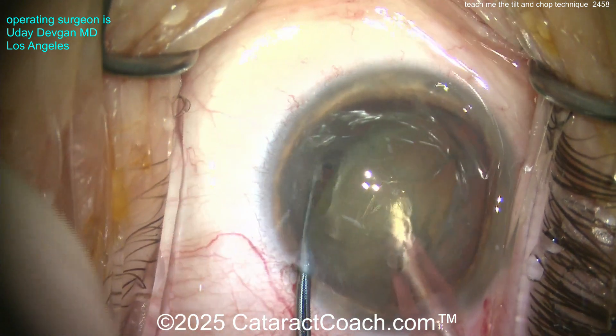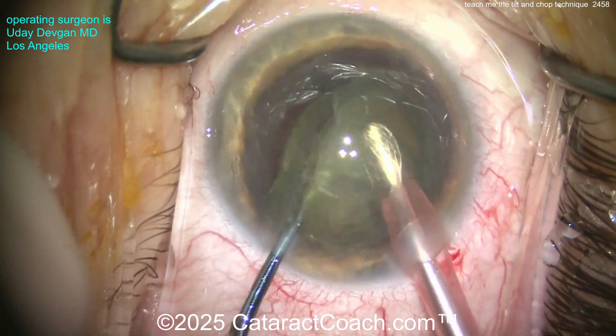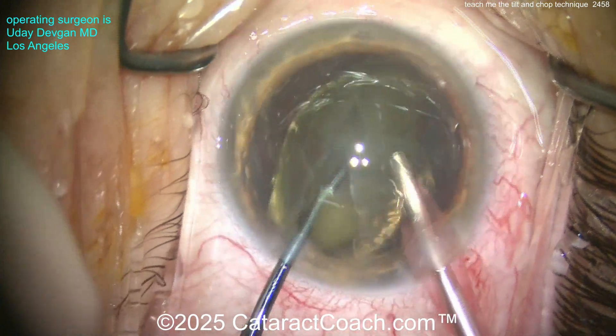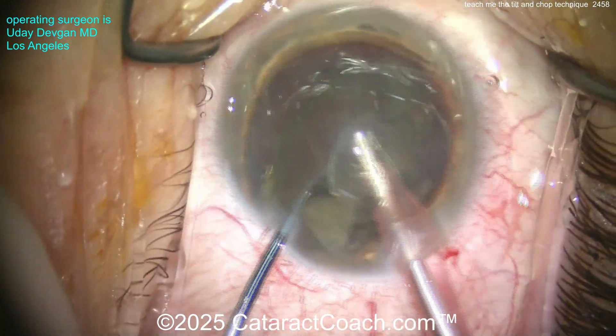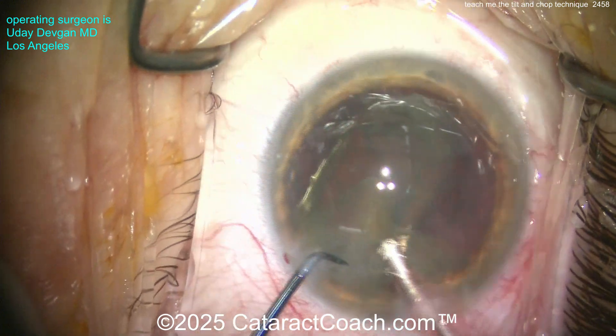Now buzzing over the phaco probe with high vacuum settings. The chopper goes around it — look at that — nucleus is trapped, boom, chopped in half. You've got two halves, and the nice part is you're not in proximity to the capsular bag. You're protecting the bag. Not a very dense cataract — I know it's Beverly Hills, although we have brunescent and white cataracts too.